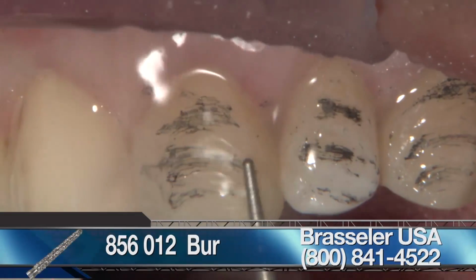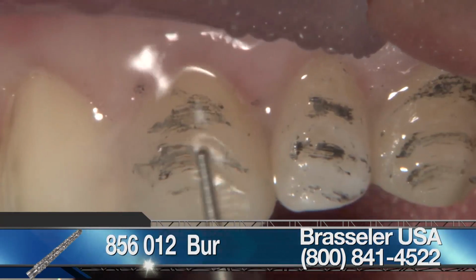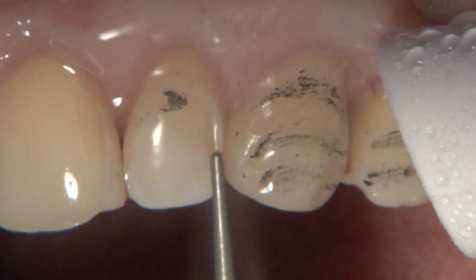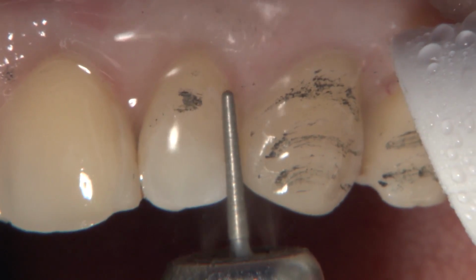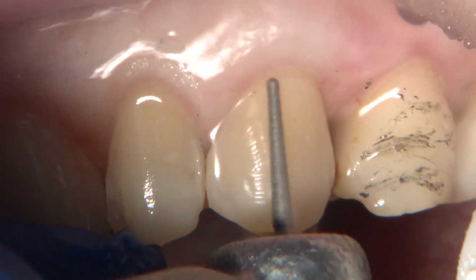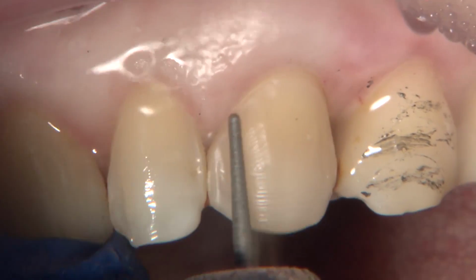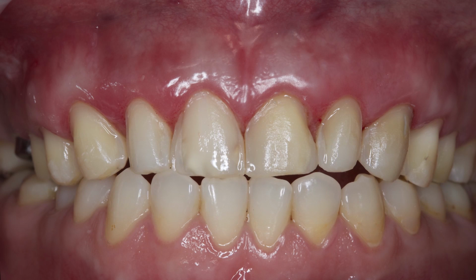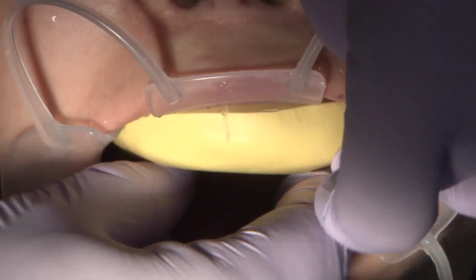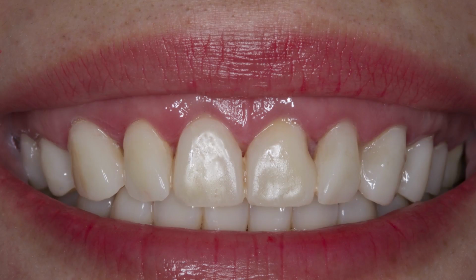To finish the preparation, a 856012 round-ended diamond burr was also used from Brasseler. This temporary mock-up prevents any unnecessary entry into the tooth and helped me keep the preparation on the enamel and precisely control my facial depth cuts. Before the final impression, the patient wore the temporary for an additional week. Great care was taken to open the gingival embrasure so as not to create any damage to the papilla.